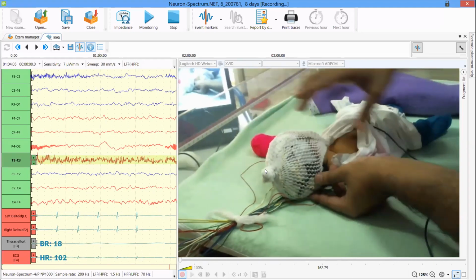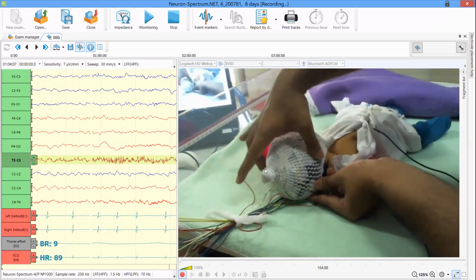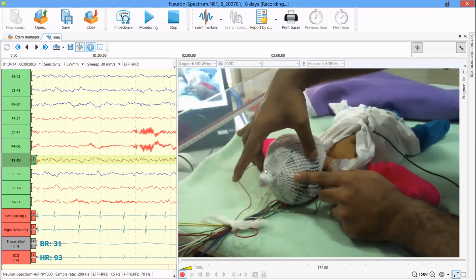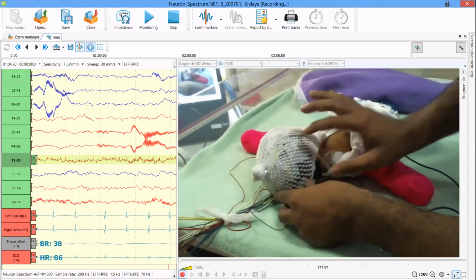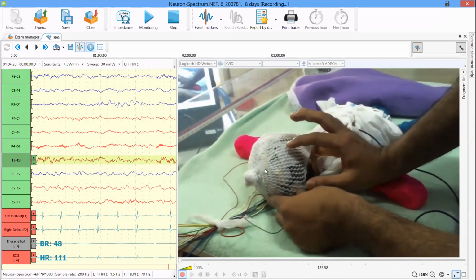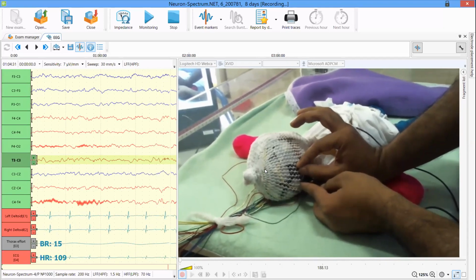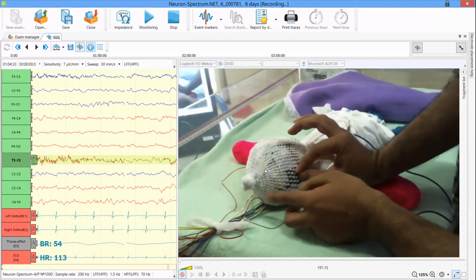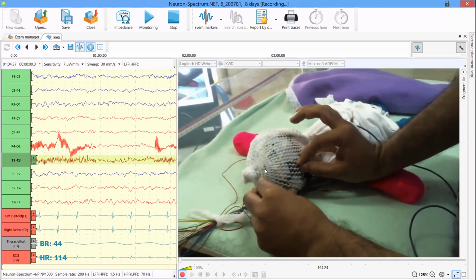And after that we have to put the electrodes. On the right side we say P4, and on the left side P3. That is how we identify the electrodes: on the right side it will be T4 and O2. Going to the middle it will be T6, and the middle of CZ and OZ is the place where we keep a reference electrode as PZ.